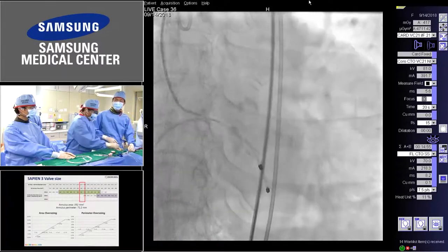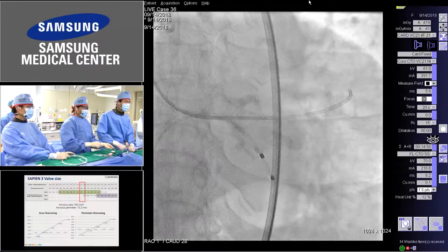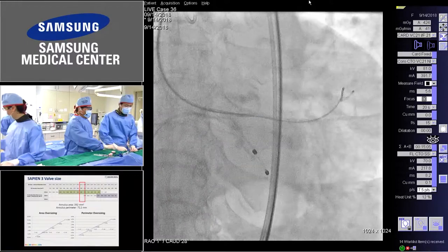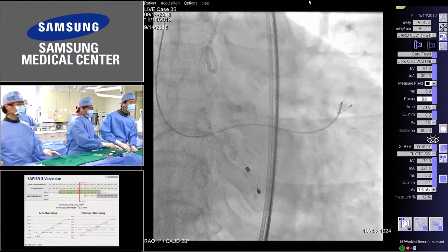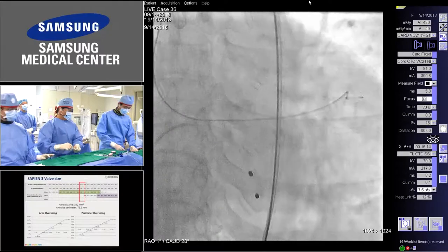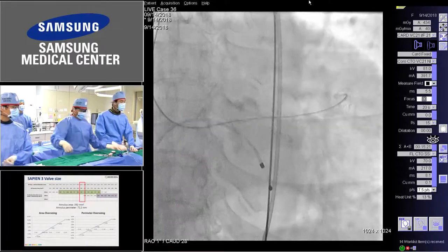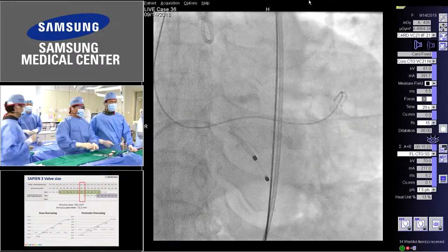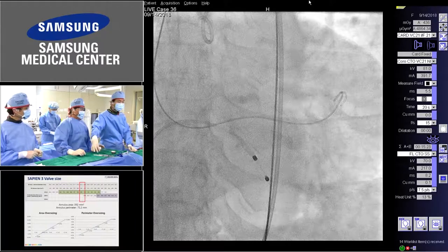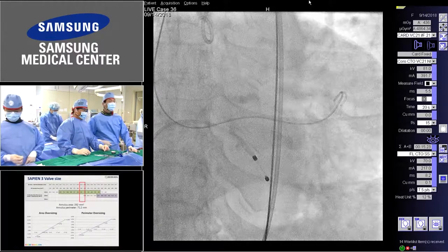So, CoreValve and Sapien valve in the same patient, CoreValve will have a larger effective EOA. Really? Is that true? I think that is still debatable. What do you think about one versus the other? To be honest, I think you can do it with both. We've seen this, and it's personal preference and experience. You can argue about this valve or that valve. I know Samsung has a lot of experience with the Sapien, so it's very comfortable. The only thing that I would not do in a bicuspid valve is oversize.